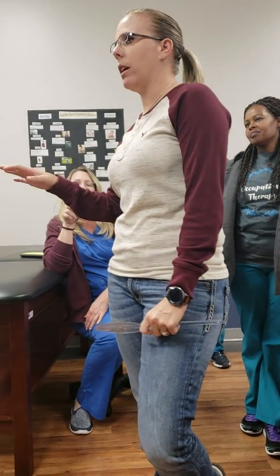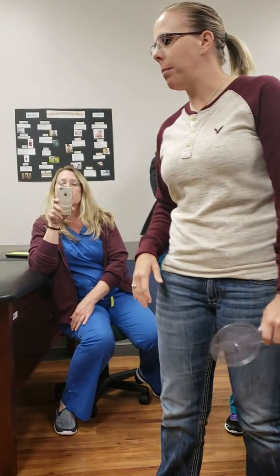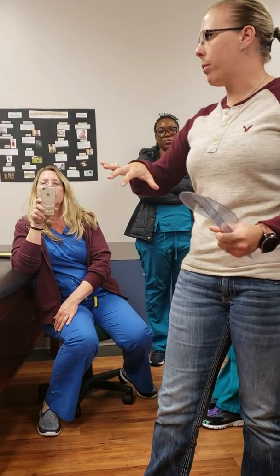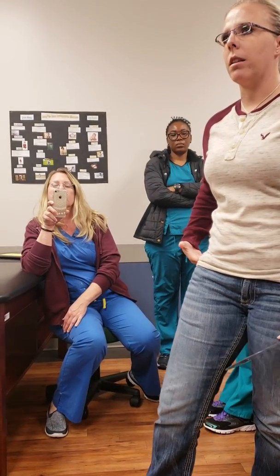For hip abduction and adduction, it is the ASIS. For internal and external rotation, it's a little different. It's the knee, and I'll show you guys that. It's really weird. And then for extension, we would just put them in prone and use the exact same spot, the greater trochanter.